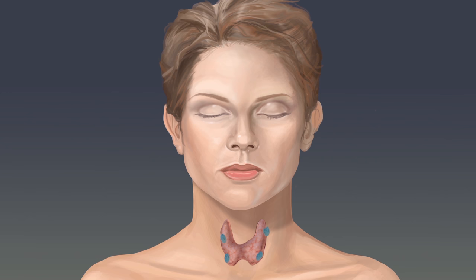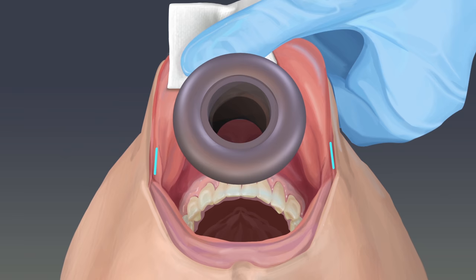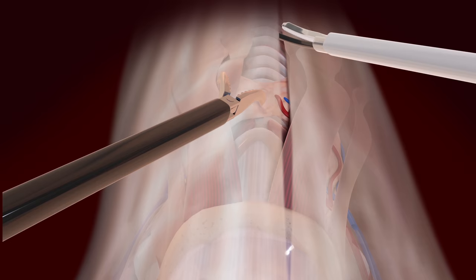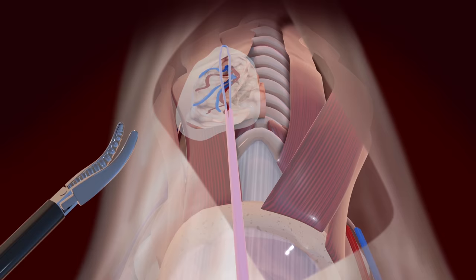A novel transoral technique allows for thyroid, parathyroid, and other neck surgeries to be completed without a visible scar. In order to remove the thyroid without a scar, incisions are made on the inside of the lower lip to allow placement of surgical ports. The remainder of the surgery is completed in much the same way as traditional neck surgery, removing the thyroid, parathyroid, or tumor in question.